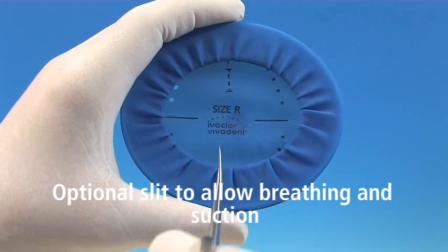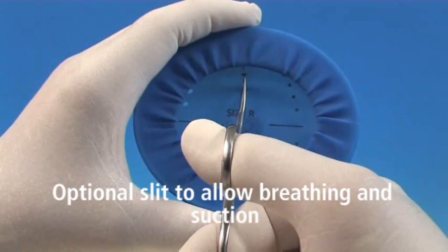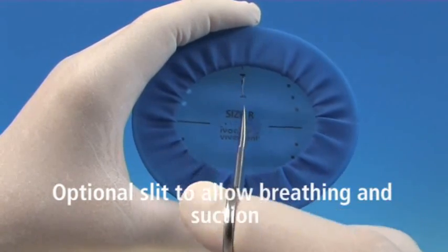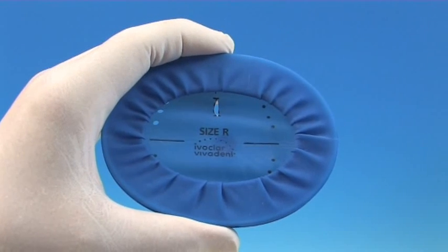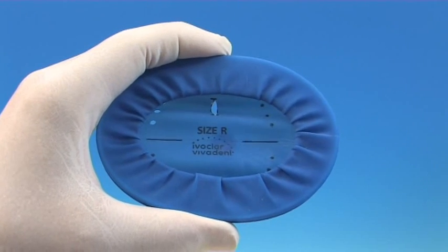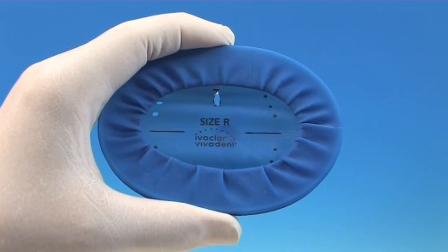In addition, a dotted line is pre-printed which may be used as a guide when cutting an optimum slit for breathing and suction. A slit for breathing is only required if, for whatever reasons, the patient is unable to breathe through the nose. A slit for suction is only required if excessive saliva accumulates.